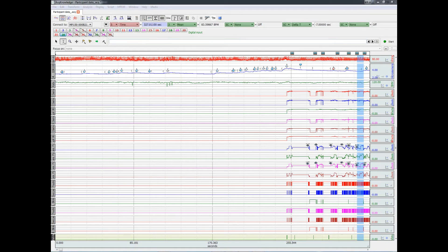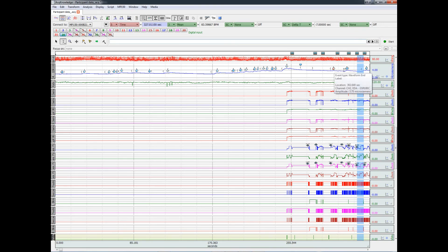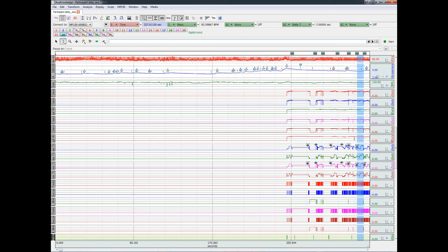We could also locate interesting changes in the physiological responses. For example, here is the skin conductance response, and see how they relate to the eye tracking data.